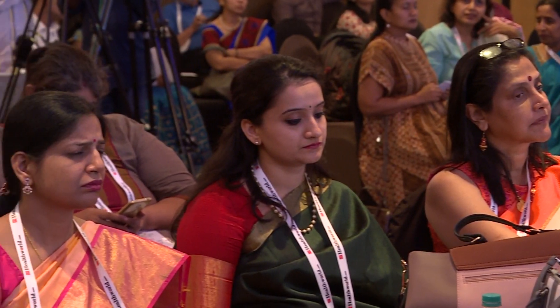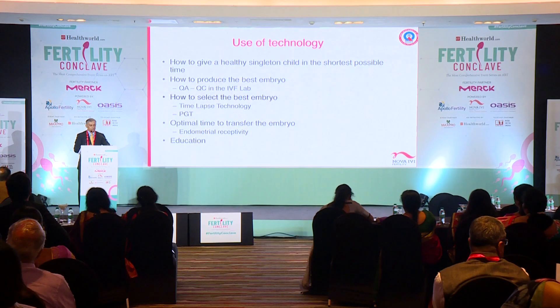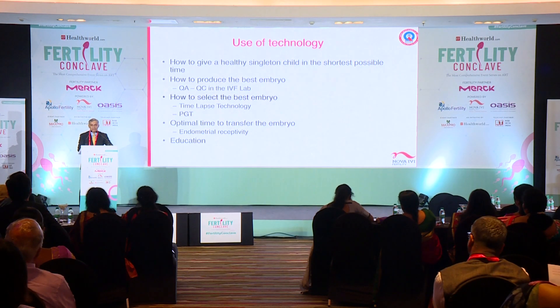This is what time-lapse technology helps with, because you have continuous monitoring. You can deselect a good-looking embryo which does not have the same implantation potential. Next is the role of PGT.